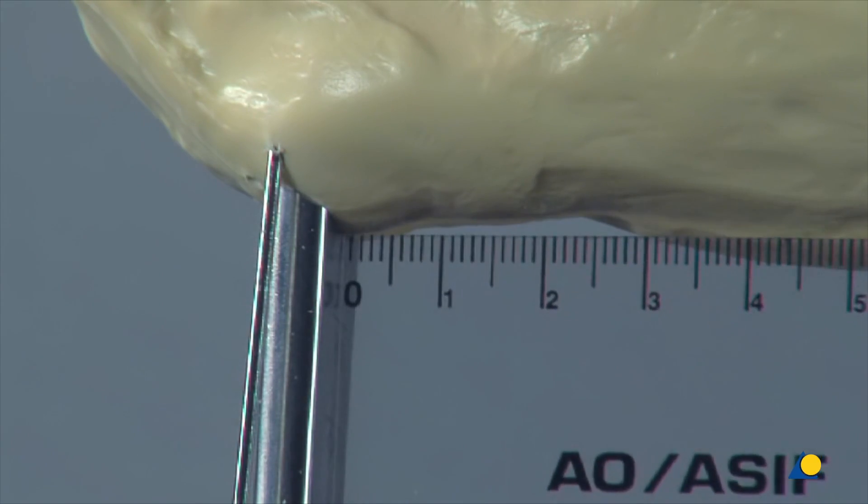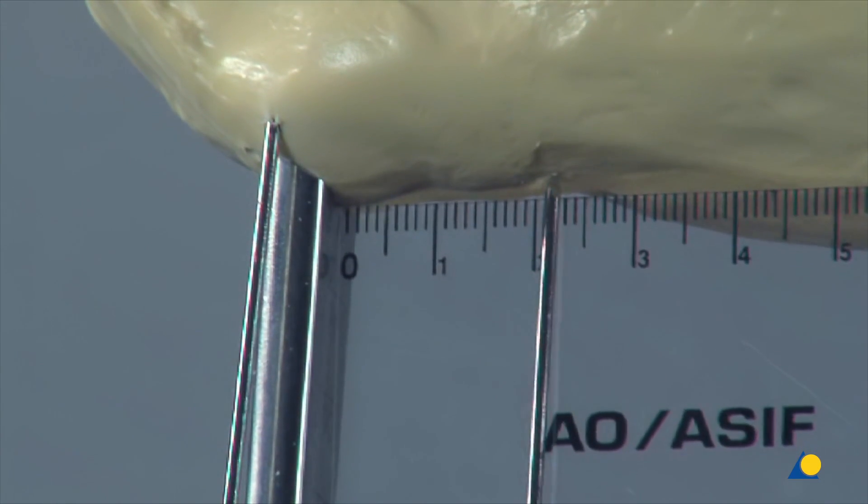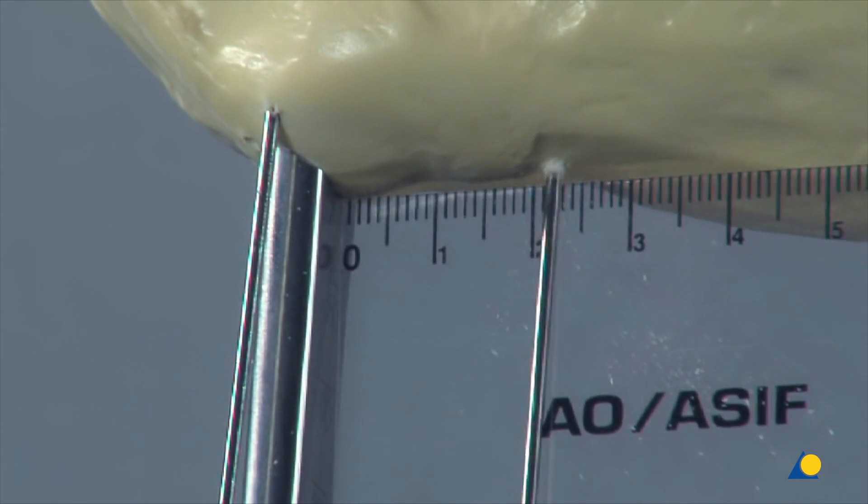A K-wire is inserted 2 centimetres below the position of the seating chisel. This will be the plane of the proximal osteotomy cut.